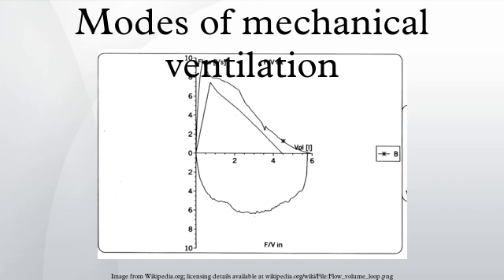Strategy: airway pressure release ventilation. Airway pressure release ventilation is time-cycled, alternating between two levels of positive airway pressure, with the main time on the high level and a brief expiratory release to facilitate ventilation. Airway pressure release ventilation is usually utilized as a type of inverse ratio ventilation.